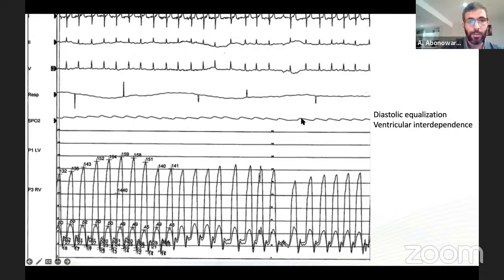Thank you, Dr. Sam. So the main thing, as you mentioned, is the so-called concordance versus discordance of the pressures. The right ventricle and left ventricle, you measure them together. In restriction, the pressures go up together. In constriction, if the pressure of the right ventricle goes up, the pressure of the left ventricle goes down, because there is no room for the ventricle to move, because of the solid, thick pericardium, whereas restrictive is actually a muscular disease. It's the muscle itself, it's not the outside of the heart.